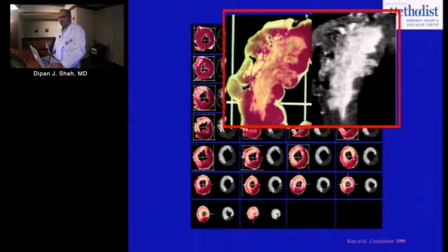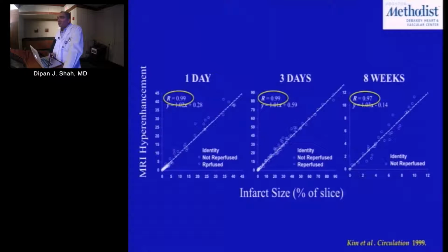Obviously, the fundamental difference here is that this requires an autopsy. This can be done in a living human being. So I think that's a fundamental difference. But it's able to give you the level of detail and the level of imaging that you could only get in the past with histopathology.